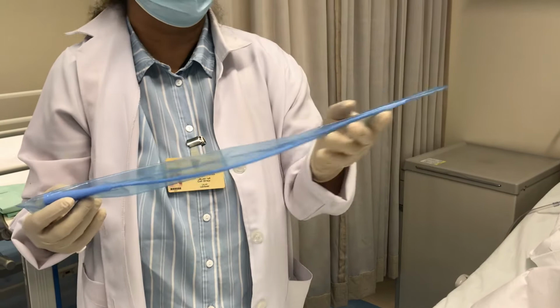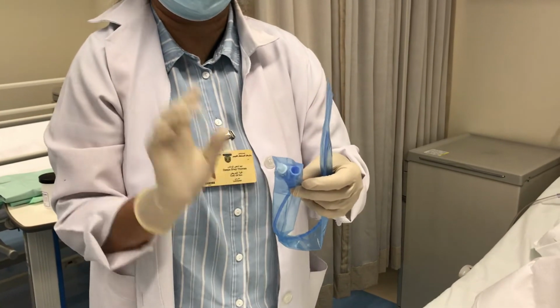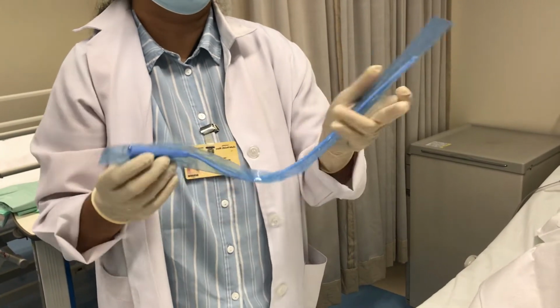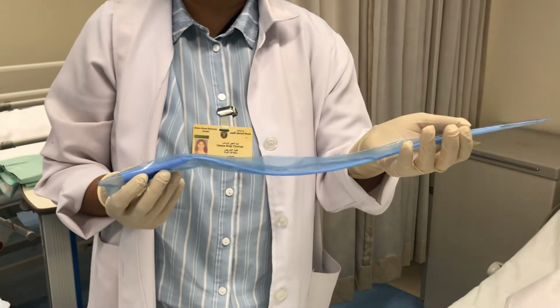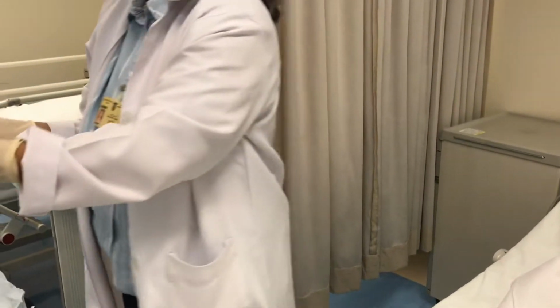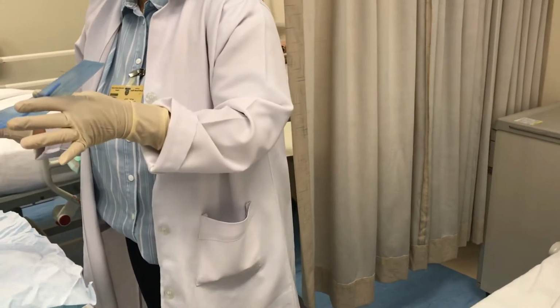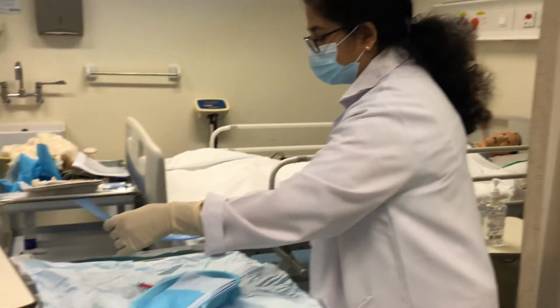I'm not going to open it completely right now. The first preparation is we will inflate and see. So I will open it from this side. After that, I will open it from here to lubricate. Then after preparing everything, when it is time, I will just insert so that everything looks sterile.